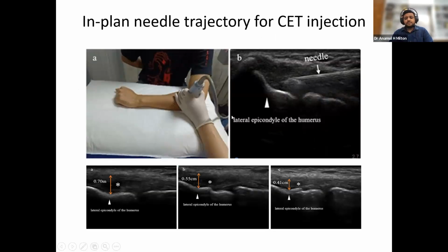There is some literature showing that at the time of injury, or before giving any medication, even needle fenestration, the tendon is more thickened. After a few months, following needle fenestration with PRP, it goes down towards normal, and it is almost normal after 6 months.